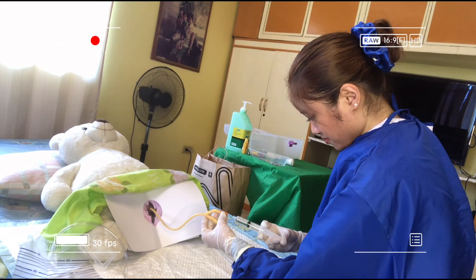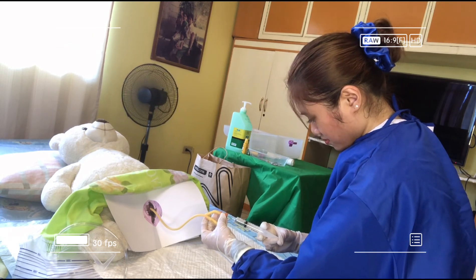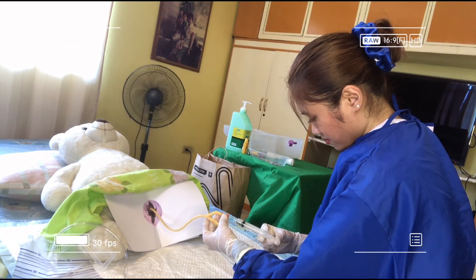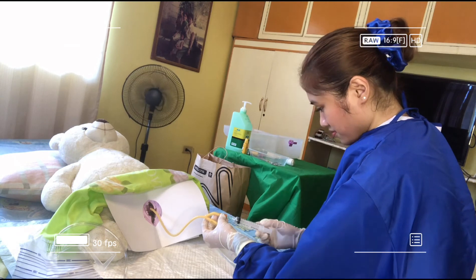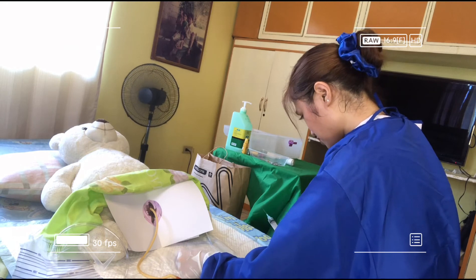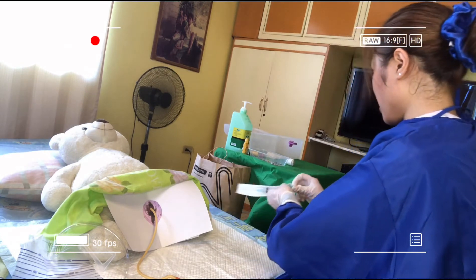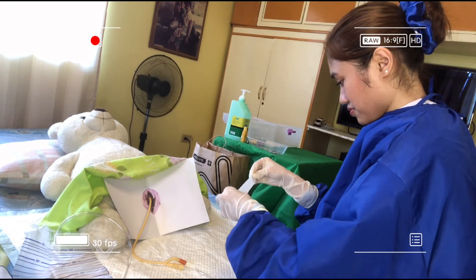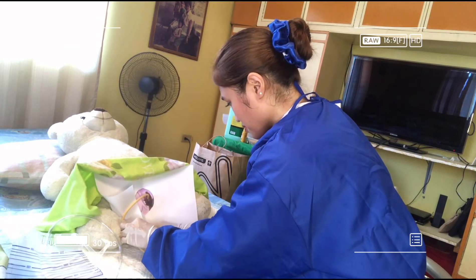Deflate the balloon and insert the catheter farther into the bladder. If the client continues to complain of pain with the balloon inflation, remove the catheter and notify the client's qualified practitioner. Once the balloon has been inflated, gently pull the catheter until the retention balloon is resting snugly against the bladder neck. Tape the catheter to the abdomen or thighs, not too tight, with enough slack so it will not pull on the bladder.